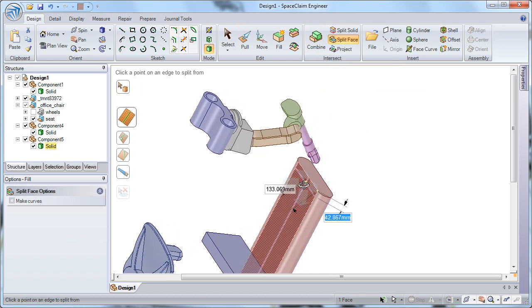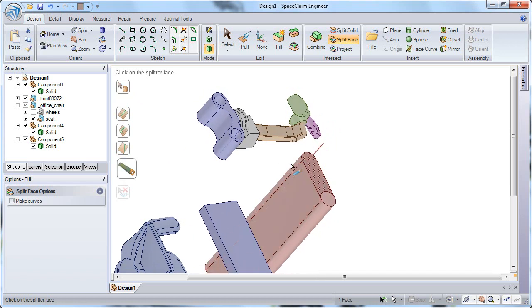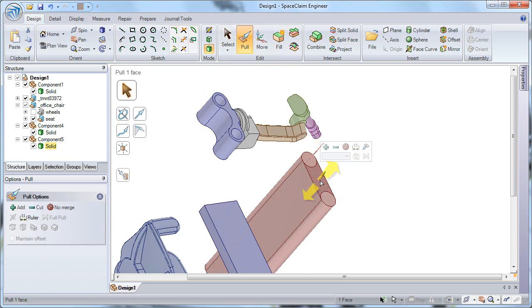And first thing I need to do is to deselect the current face that I selected, or that was pre-selected. So I'll click in white space and then click on the face to select that. Notice that by default it's giving me UV vectors to split that face, but I can toggle to my tool guide with the saw tool to select a cutter face. And if I select that front rounded face, it'll split that top face according to that geometry, and I get now two faces. I can select on that face again to split it a second time, choose the back rounded face, and now I've split that top into three separate coincident faces. I can pull on that middle segment to remove material to create those two arms.